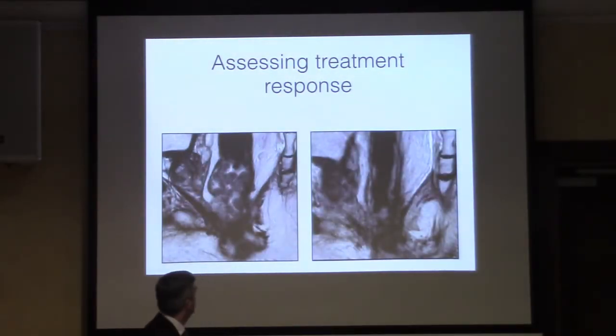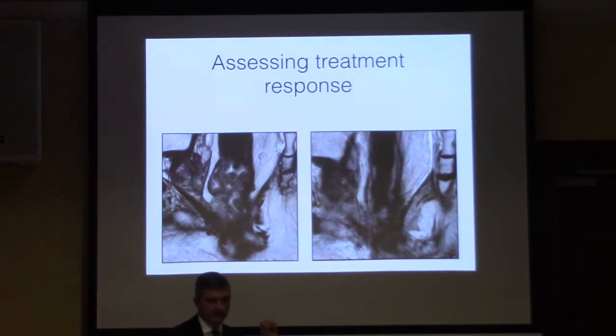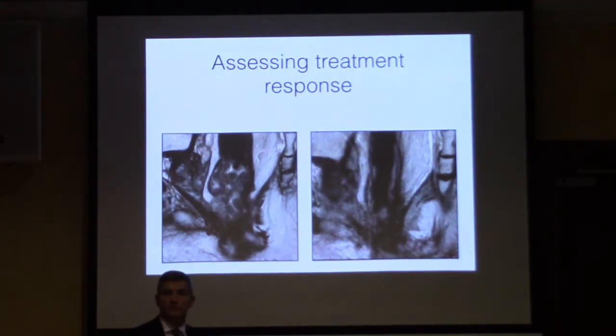If you look at this patient here, big bulky tumour down onto the anal canal, possibly T3 either side, not going to get a clear margin. So this patient has had radiotherapy with the hope to shrink the tumour and then render it safe to do an operation. Well, actually, now all we can see is high signal intensity in the submucosa. That's often how the submucosa responds with radiation. You can see this high halo of T2 high signal. And actually, you can't reliably see any tumour at all. So this has been a complete response.